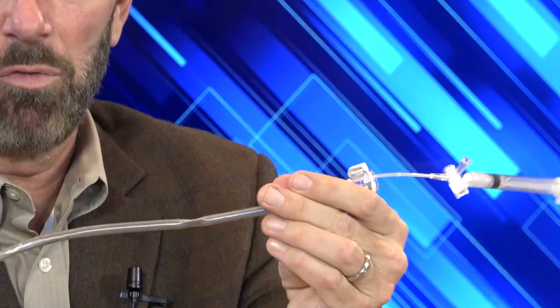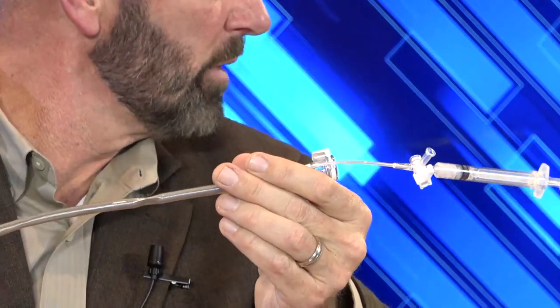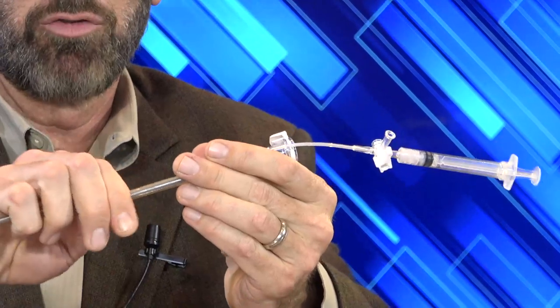You can fix this the same way you'd fix a coronary artery or peripheral artery. You go through with a balloon, and you plasty it open. We've done that with a non-compliant 12 by 20, gone through and had to plasty it open if somebody grabbed a little too aggressively with the cannula when they were trying to advance it.